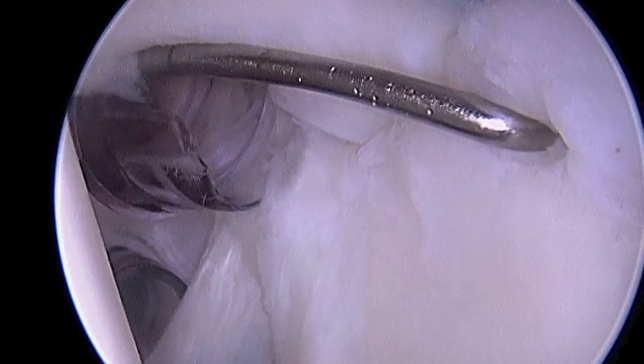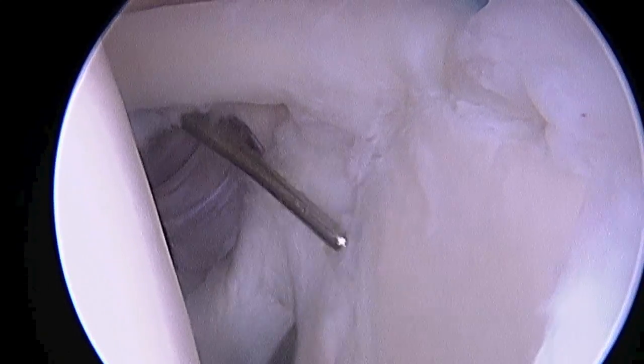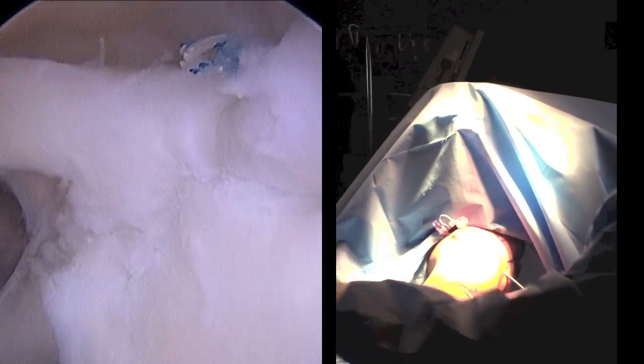Now you can see how the stability of the superior labrum has been restored — it doesn't pull away from bone anymore. Then we take the shoulder through a full range of motion. You can see now as I externally rotate the shoulder there's no peel-back or displacement of the superior labrum.